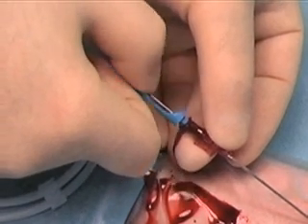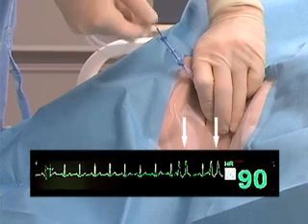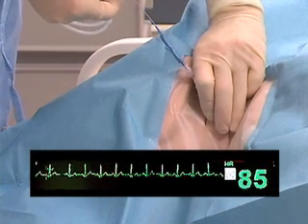An assistant should watch the monitor, looking for signs of arrhythmia during advancement of the guide wire. Arrhythmias indicate that the wire has reached the heart. If arrhythmias occur, withdraw the wire slightly until they cease.